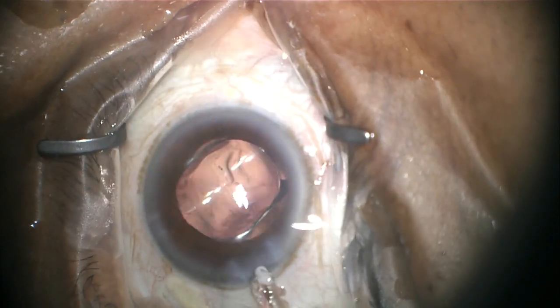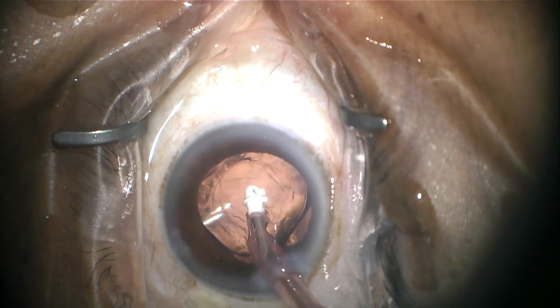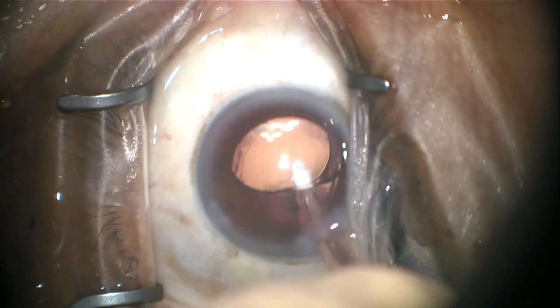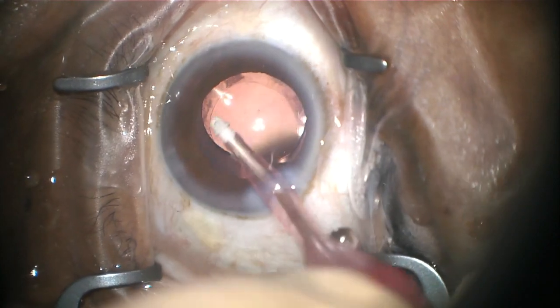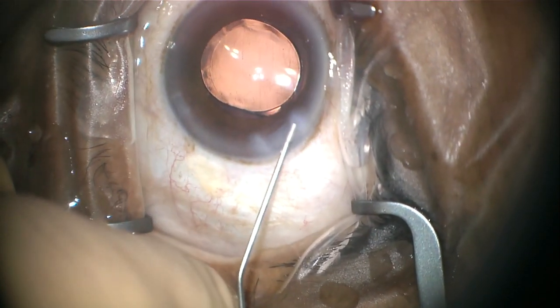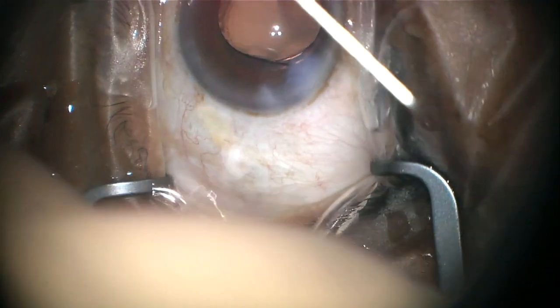Once that lens has been centered inside your eye, the irrigating and aspirating cannula is then reinserted and the remaining viscoelastic gel is removed. Once all that gel has been removed, fluid is then used to swell the edges of those wounds. This prevents us from having to put any stitches in the wound whatsoever.